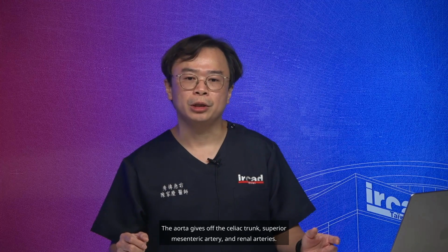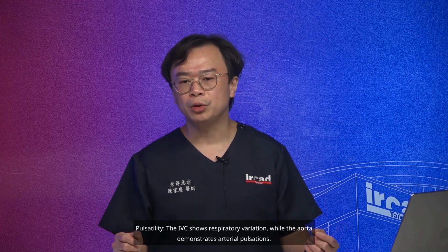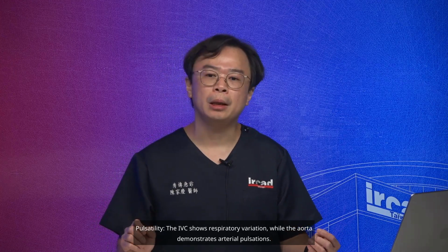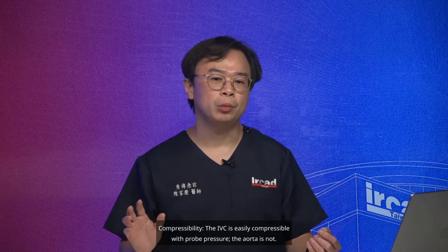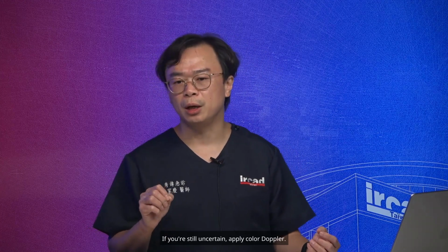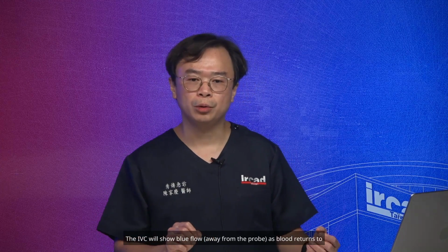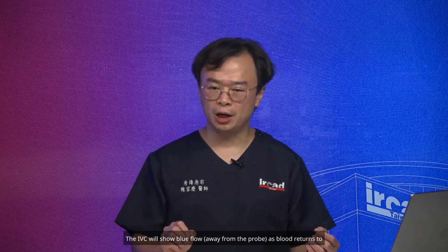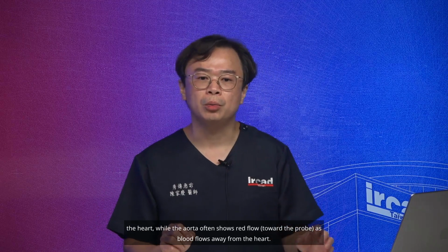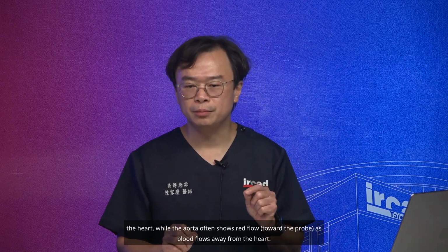Pulsatility. The IVC shows respiratory variation, while the aorta demonstrates arterial pulsations. Compressibility. The IVC is easily compressible with probe pressure. The aorta is not. If you're still uncertain, apply color Doppler. The IVC will show blue flow away from the probe as blood returns to the heart, while the aorta often shows red flow toward the probe as blood flows away from the heart.